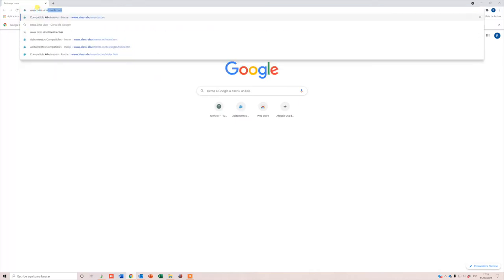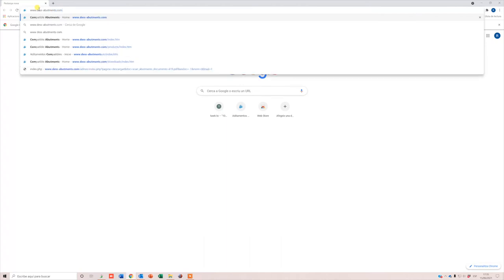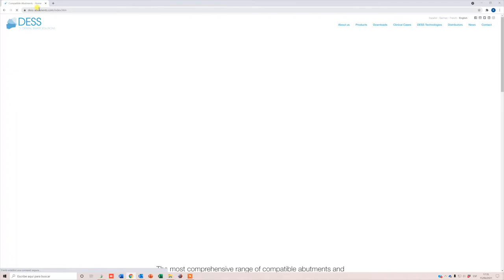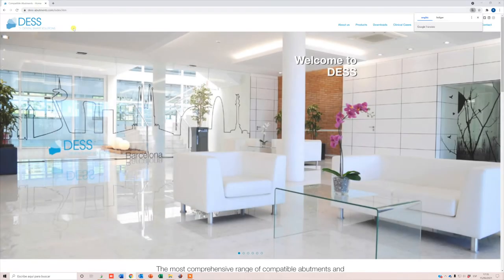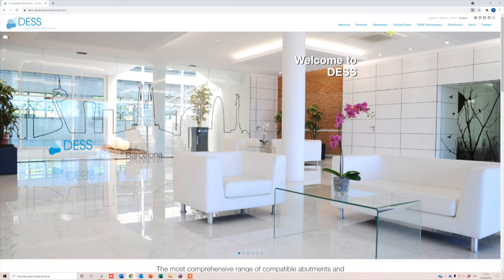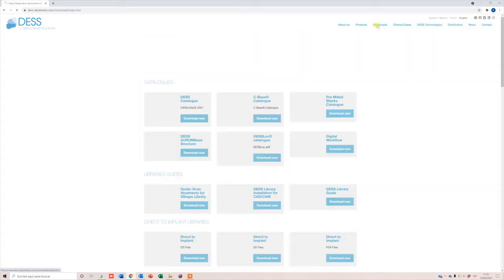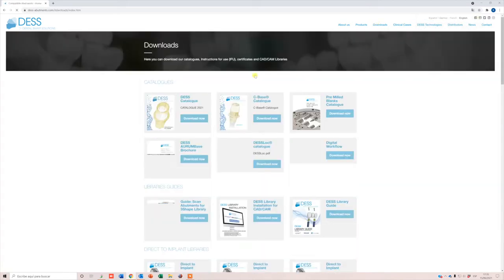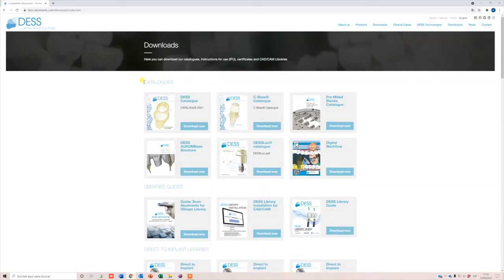Open your browser and type desabutments.com. Go to the Downloads area. You'll see several categories.